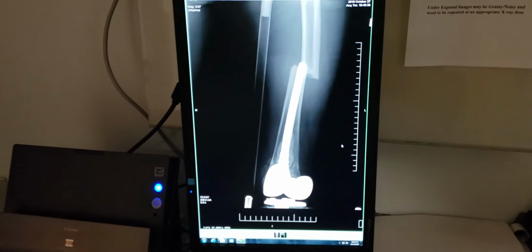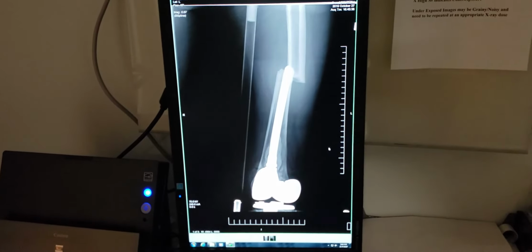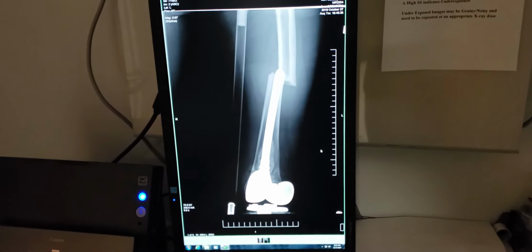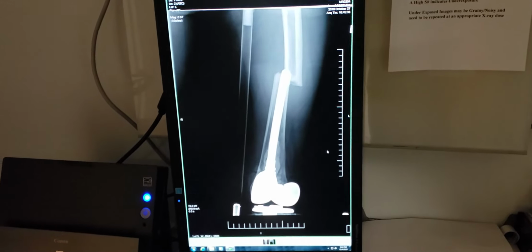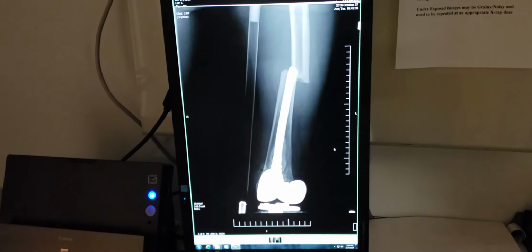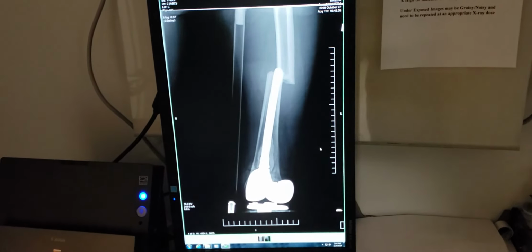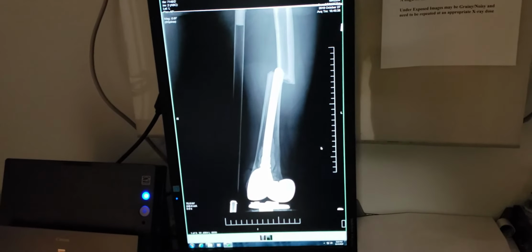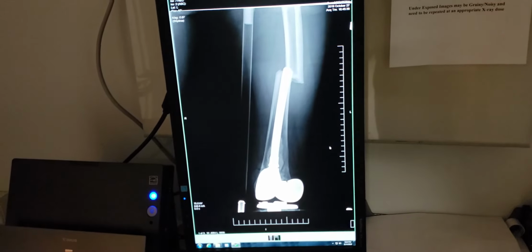The patient was shielded. Even though the tech was moving fast, she still wanted to make sure she protected the patient. And the tech explained the exam to the patient as they were doing the exam, especially since the patient's already in pain and not as comfortable in any position. So the tech made sure to have the patient be comfortable, especially by explaining what was happening.